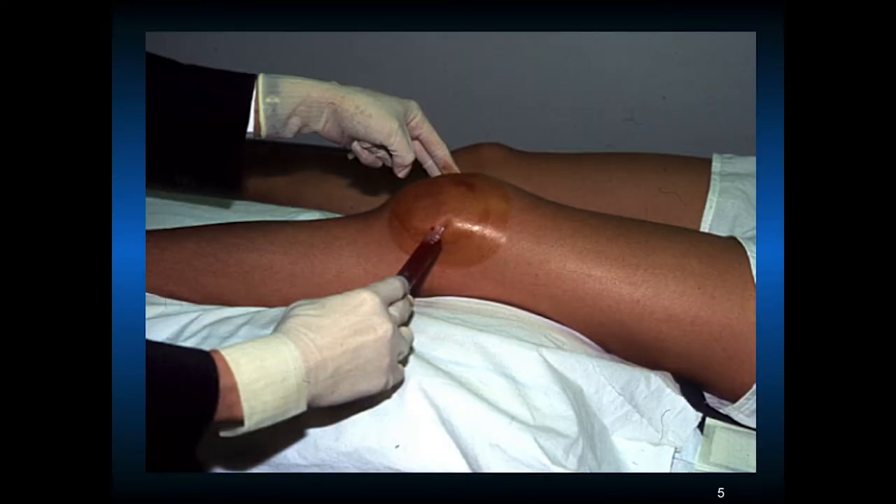What does hemarthrosis look like? Prep the skin — do this sterilely with sterile gloves. This is a hemarthrosis, meaning there's blood on the inside of the joint. I push the patella lateral and go just behind the patella. It's pretty easy to tap a knee this way. There are other ways knees are aspirated — you can do it in a flexed position through the fat pad, but that's relatively painful. In my experience, the best way to get into the knee is going lateral behind the patella at the superior aspect of the patella, with somebody else pushing the patella medially.